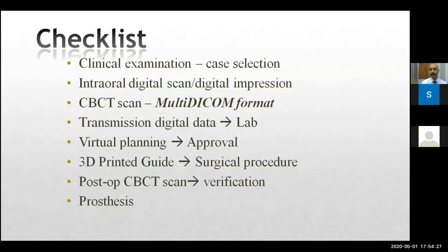Swapnil demonstrated. That virtual planning will then be sent to you. The approval has to be done by the implantologist. Once the approval is received by the laboratory, we then do the 3D printing of the guide. Once the 3D printing of the guide is done, that guide is delivered to the implantologist. The implantologist then goes about performing the surgical procedure.